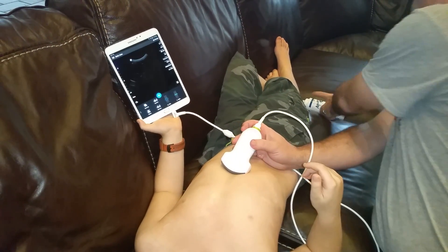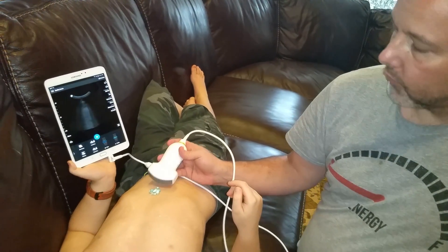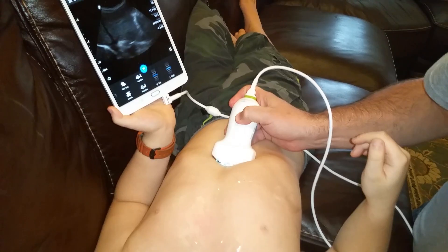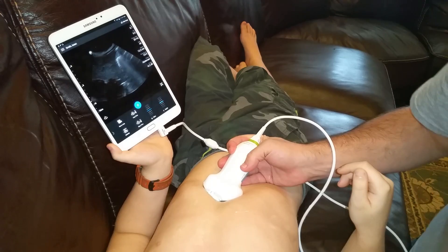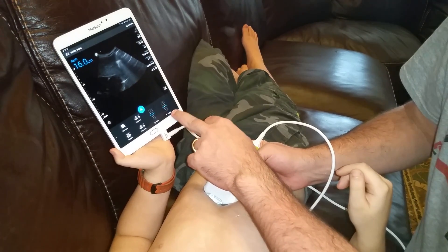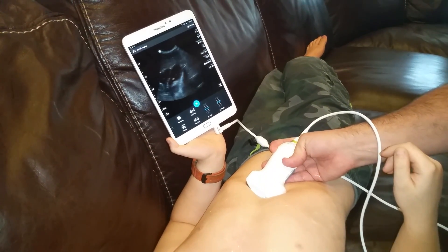We're now in the belly. If your images aren't good, you can always try putting some more gel on. Initially we're seeing a picture of the liver. My goal is to try and take a look at the heart from here, and we can make it deeper by increasing the depth — and there we go.